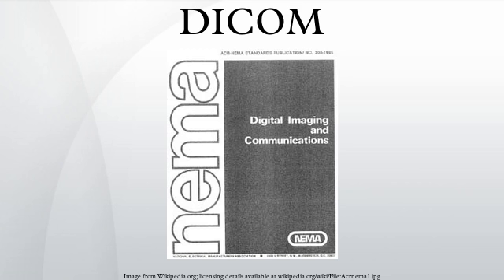C.7.3.1.1.1 of PS 3.3 2011, Information Object Definitions (PDF/A, 6.51 MB). Port numbers over IP: DICOM have reserved the following TCP and UDP port numbers by the Internet Assigned Numbers Authority: 104, a well-known port for DICOM over Transmission Control Protocol or User Datagram Protocol. Since 104 is in the reserved subset, many operating systems require special privileges to use it.